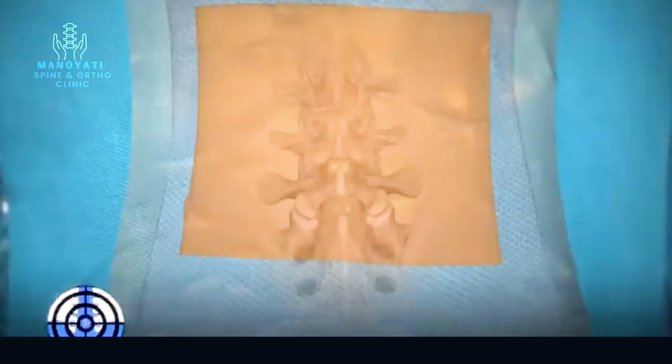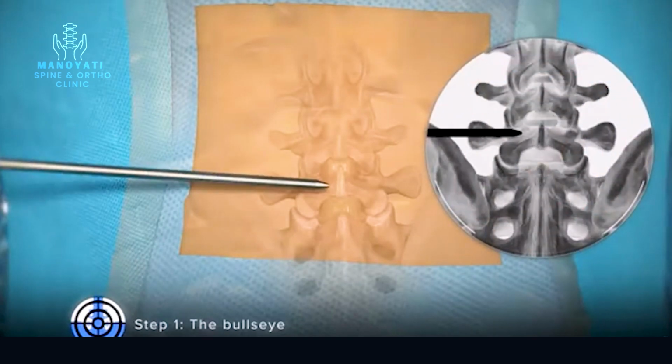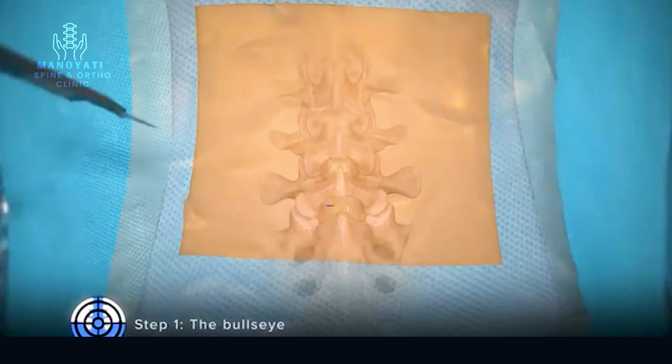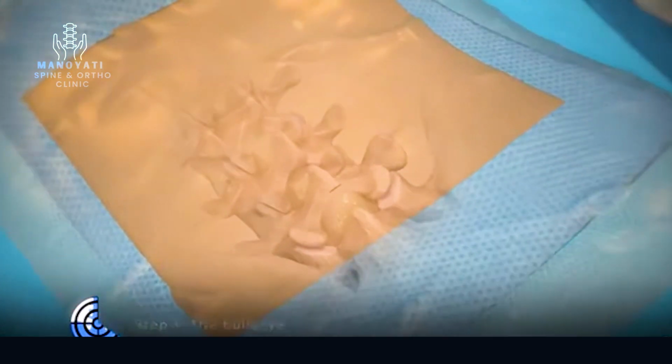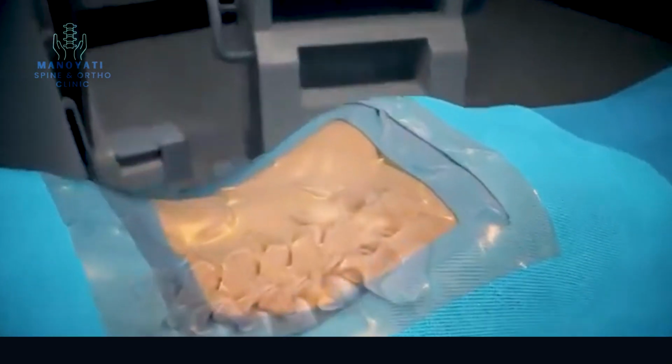Step 1. The bullseye. Use a switching stick to identify the entry point, which is the lateral aspect of the ipsilateral interlaminar window. Make an incision between 8 to 10 millimeters through both the skin and fascia. An alternative method utilizing serial dilators can also be used.